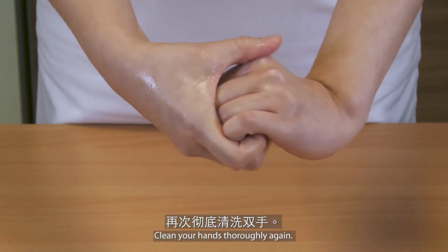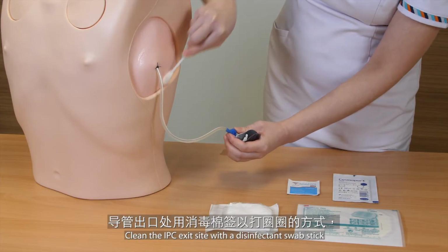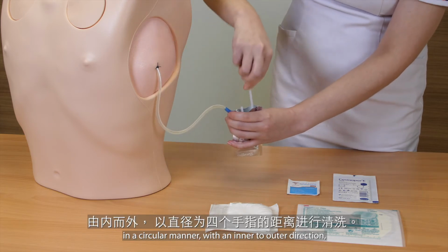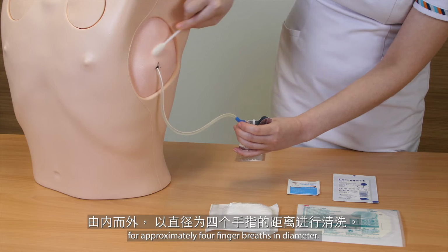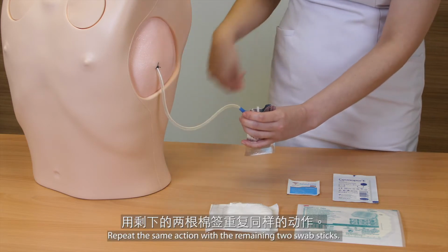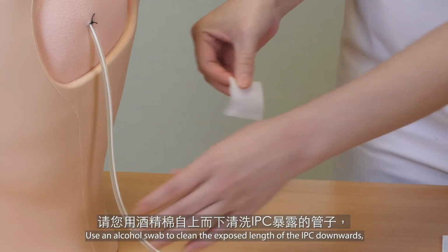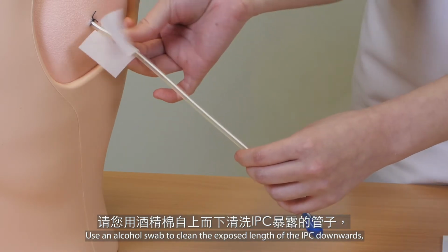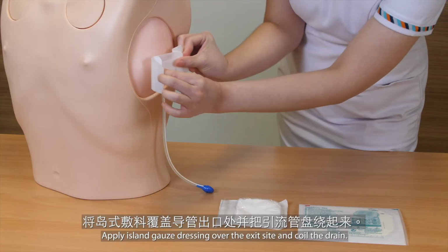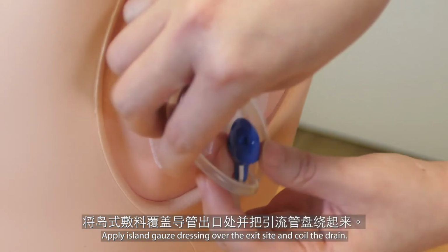Inspect the IPC site for any redness, swelling, fluid discharge, and loose or broken stitches. Clean your hands thoroughly again. Clean the IPC exit site with a disinfectant swab stick in a circular manner with an inner to outer direction for approximately 4 finger breadths in diameter. Repeat the same action with the remaining 2 swab sticks. Use an alcohol swab to clean the exposed length of the IPC downwards away from the insertion site. Apply island gauze dressing over the exit site and coil the drain.